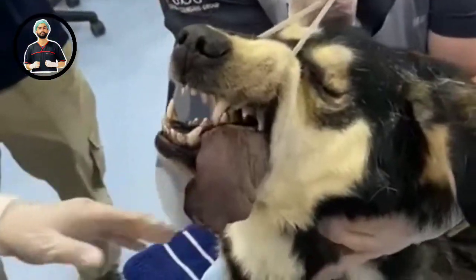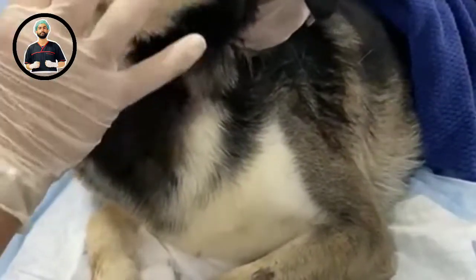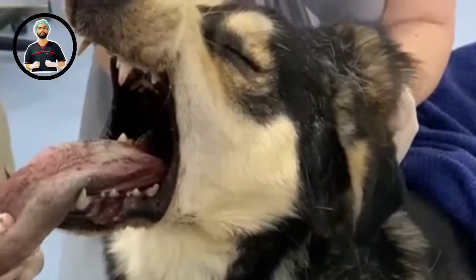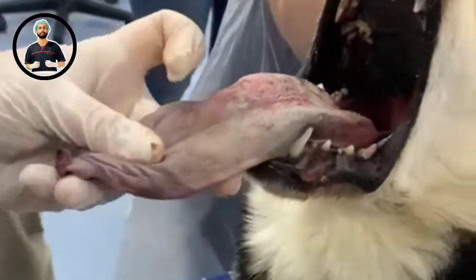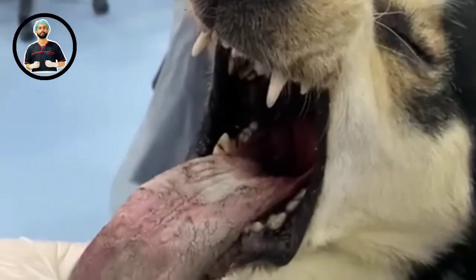Try and get them positioned with their head elevated so the neck area is exposed and open. Ideally the shoulders would be straight, but this dog is still partially frozen. Use index finger and thumb to open the mouth. Laryngoscopy is ideal — you have light and you just pop it to the back of the tongue to push it down, which opens up the airway for you to see. Pull the tongue as forward as possible. The dog is under anesthesia so you can afford to be firm, more than you would in a clinical examination.